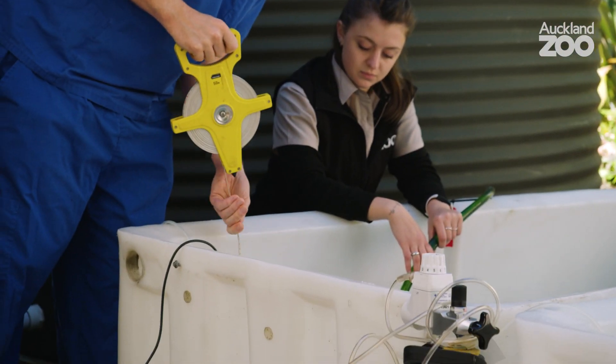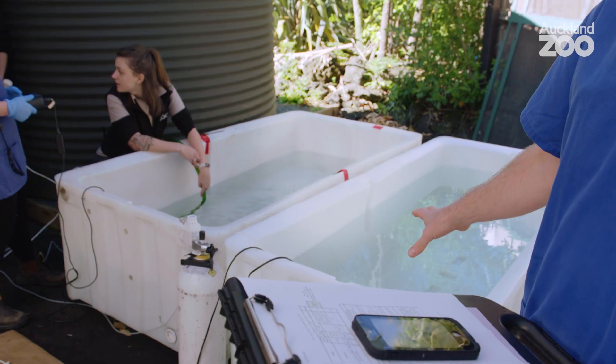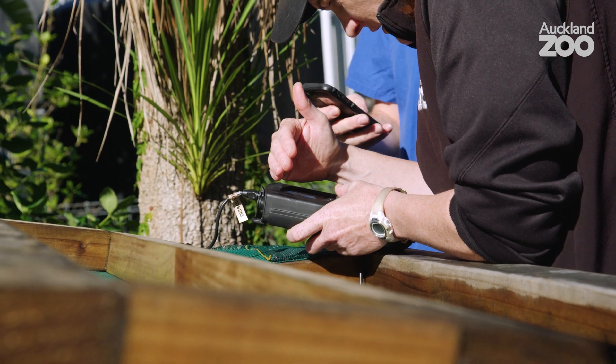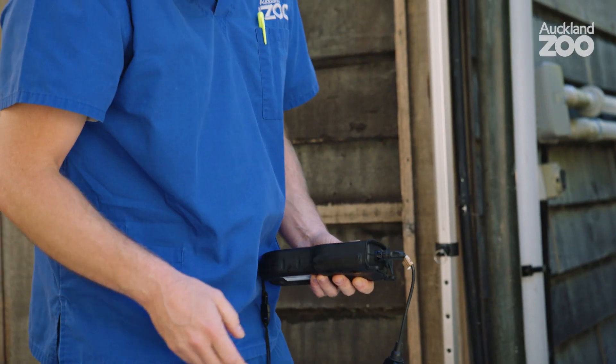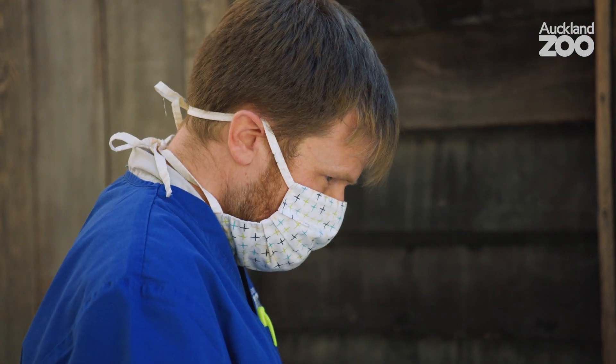We're getting the water set up for the eel — we've got one body of water that's going to have the anesthetic in it, and then a second without anything in it for recovery, and this is water the fish is used to. Julie and the ectotherm team know the range the eel is comfortable in, and we're generating the warmer half of that range, mimicking what it might do if it swam into the shallows of a pond where it's a bit warmer on a sunny day.